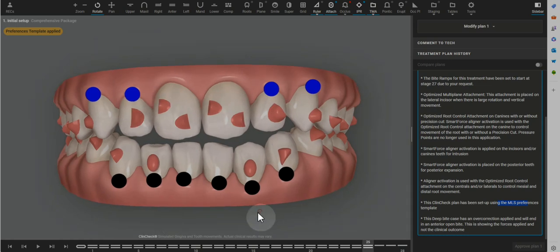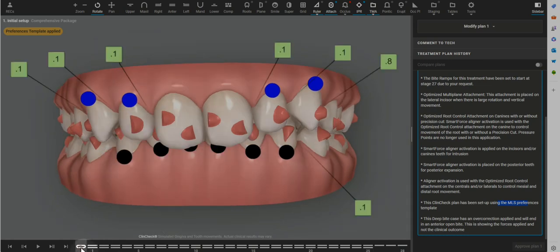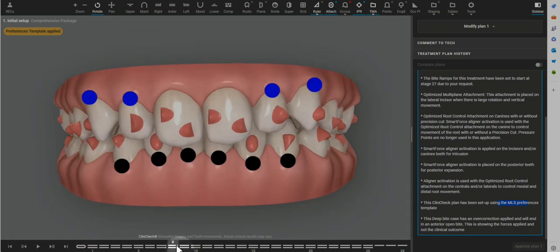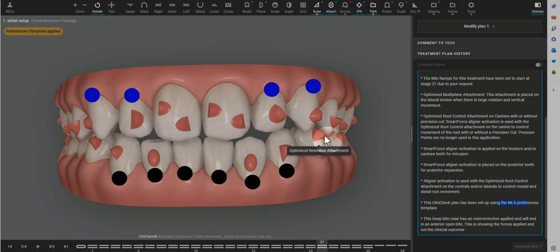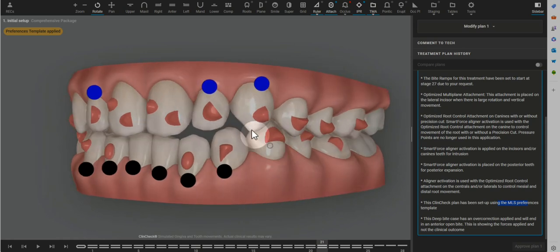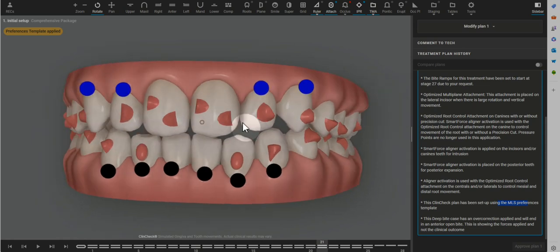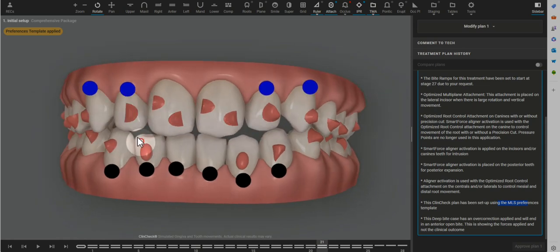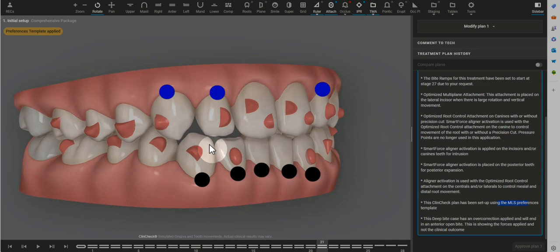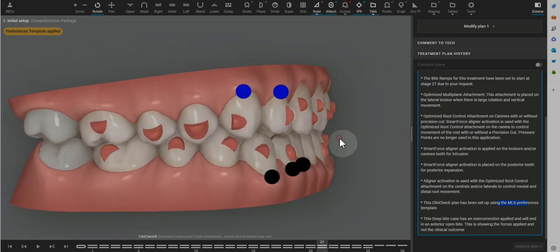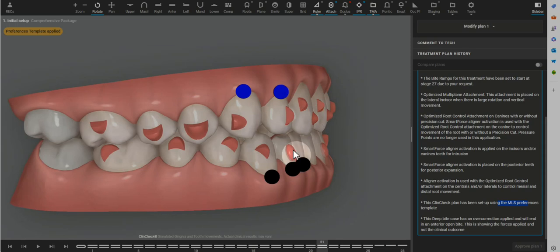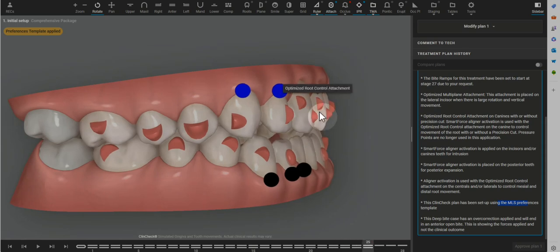So in order to achieve intrusion, retention is absolutely paramount. So changing these lateral attachments to optimized retention or optimized support attachments is very helpful to realistically get the intrusion of the central incisors.